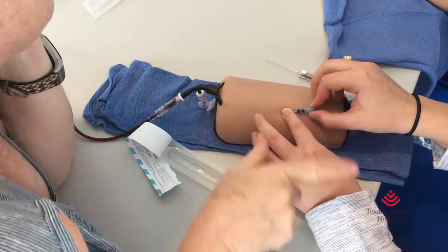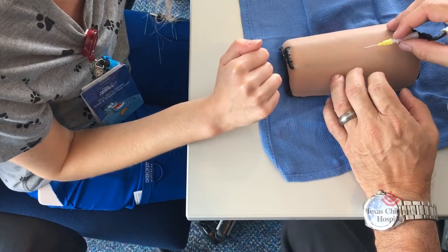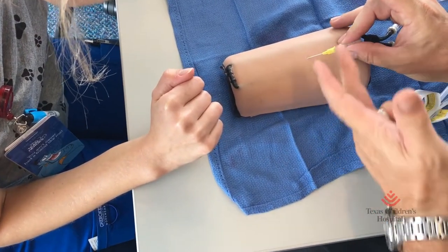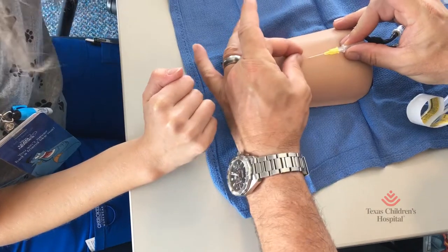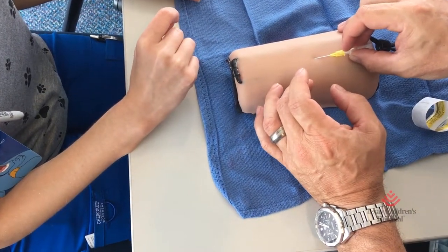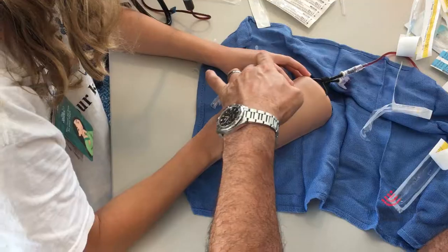Now take it out. Great job. Say I got flash right here — I drop it, and I'm anchoring the needle up against the patient's skin and I'm grabbing with these two fingers and then threading it like that. Or if I'm really good, I can use my pointer finger and just go whoop. That's why you don't — to the flash chamber — as you're advancing.